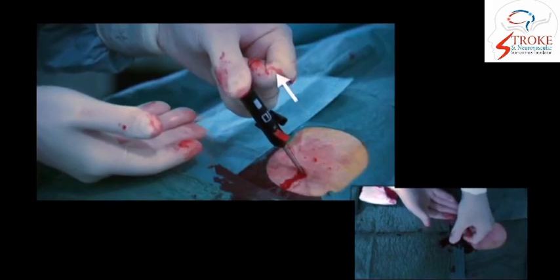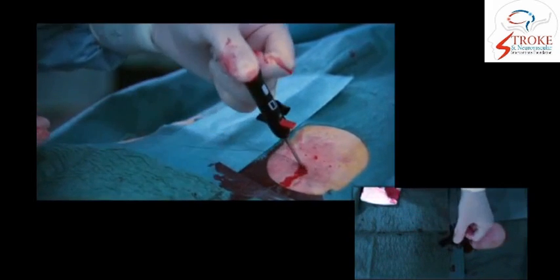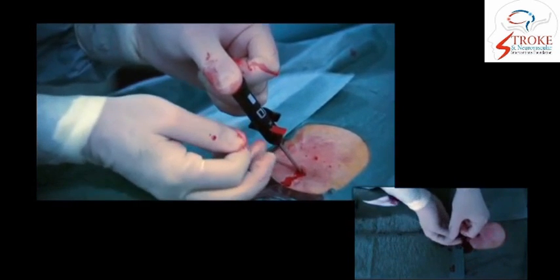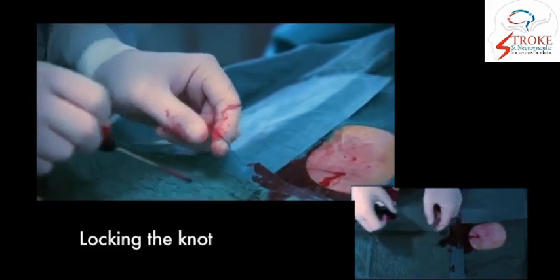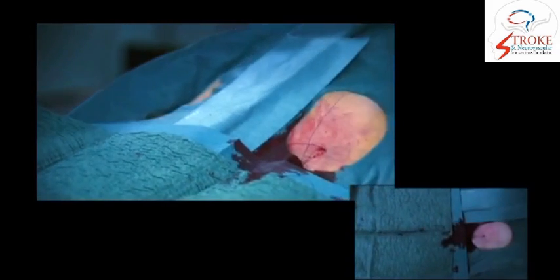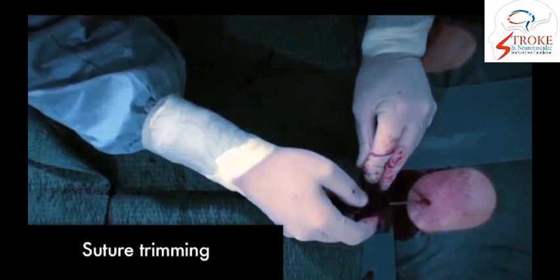Again, the angle is very important. And once the knot is pushed and tightened, then the same device is used to trim the sutures. It is being checked for any bleeding.